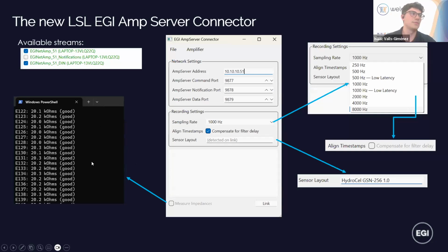You're then free to use that to customize your own visualization, either a topographic map or any other thing that you would like to visualize, maybe similar to NetStation with colors. It's free for anyone to use and customize. So that's all the main updates.